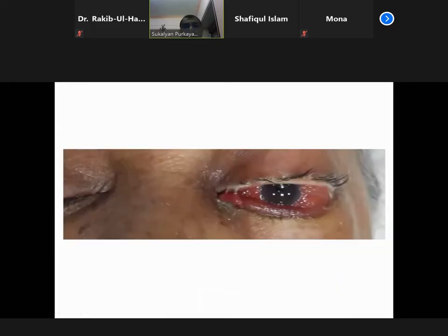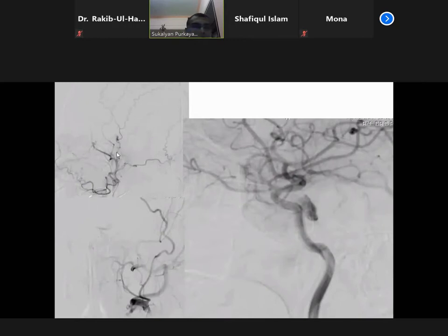It's not different, and like this, the patient comes to you. The patient will typically say that it has happened over quite a long time, and usually he does not present with any tinnitus. He can't see any abnormal flow inside his head, can't hear. So obviously, again, you have to check. What we see is a very tiny fistula here from the middle meningeal maybe, or from the superficial temporal artery. Mostly these are supplied by the dural branches of the ICA. So why is it draining anteriorly? Because the posterior drainage of the cavernous sinus is blocked.